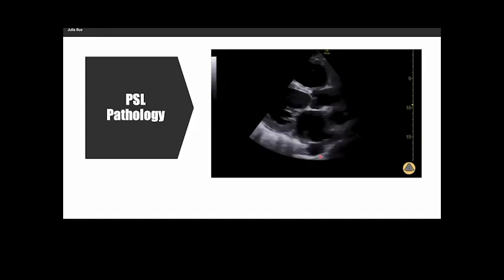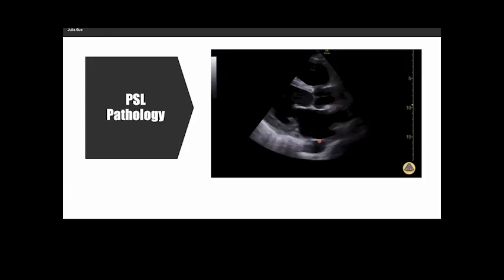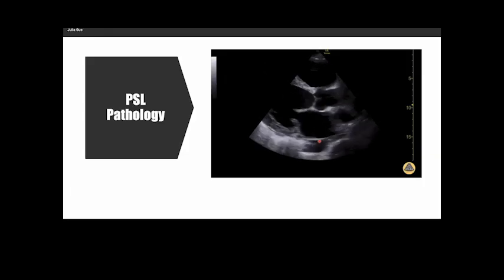Okay, so if you're seeing a patient in the field with an EF that looked like this, and they had all those B lines, right, worrisome for pulmonary edema, well, if you combine these two images together, then you should be worried about a CHF exacerbation, right? Flash pulmonary edema. This may be a patient who will benefit from some nitroglycerin, okay?